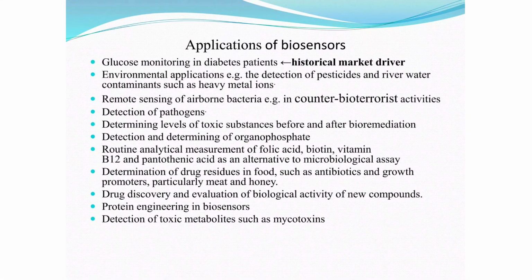Early glucose monitors, known as first generation biosensors, faced major technological challenges like oxygen limitations, where variations in blood oxygen levels cause errors. So to solve this, we use second generation biosensors, which replace oxygen with chemical molecules that we call electron mediators.